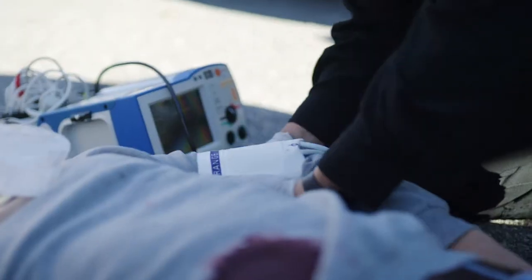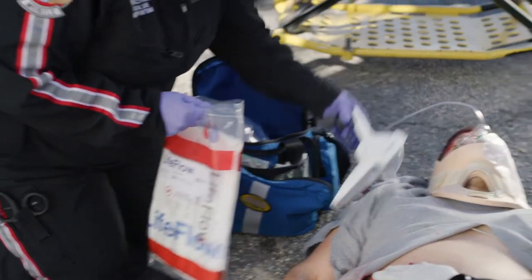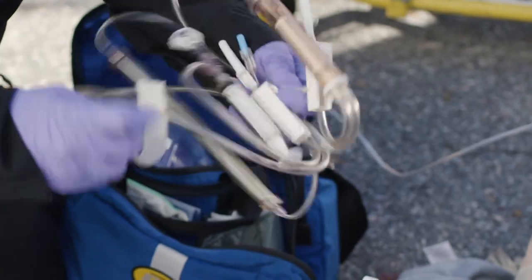This is paramedic one, trauma alert. I think we should do blood through the LifeFlow. The LifeFlow Plus includes the handle and blood tubing in a single package for easy setup.